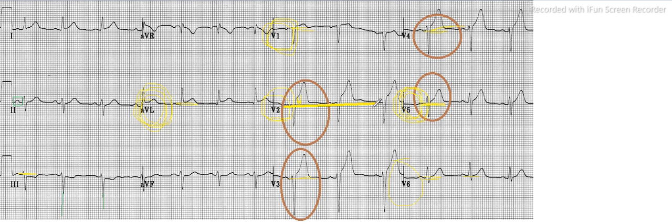And yes, this is the thing. So this way we can conclude the MI.